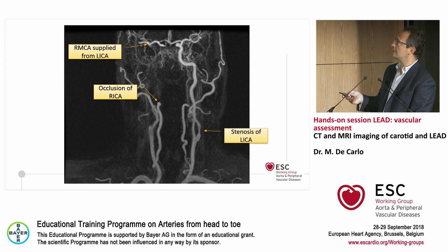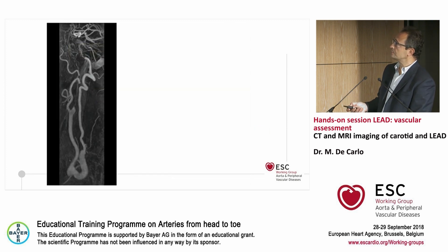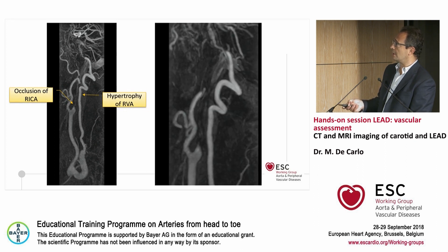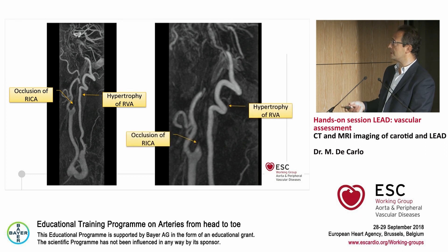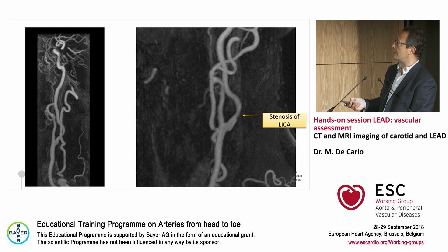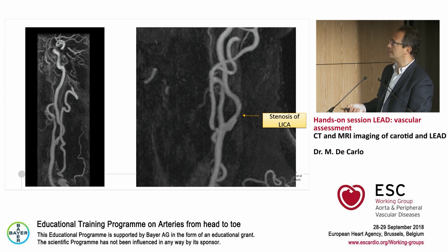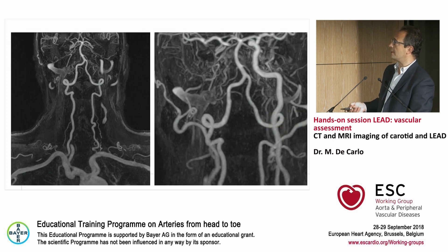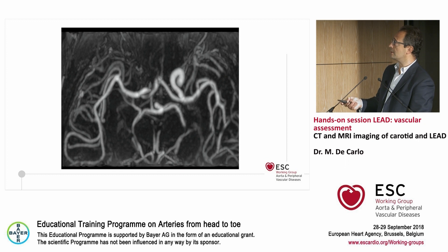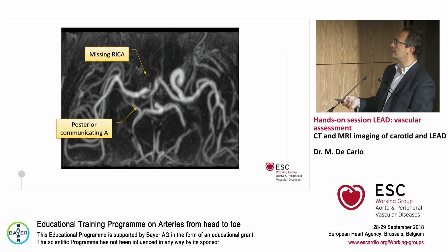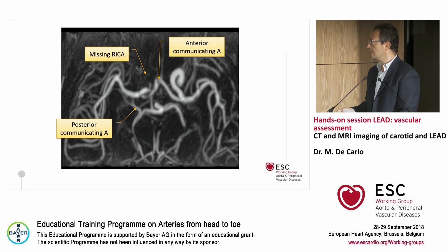On the intracranial MRA, you can see that the right middle cerebral artery is supplied from the left internal carotid artery. You can magnify the images and see the stump of the right internal carotid artery and the hypertrophic vertebral artery that compensates for the occlusion. The stenosis of the left internal carotid artery is clearly visible. You can see the posterior circulation with the basilar artery and posterior communicating arteries — the polygon of Willis — demonstrating that this patient has good collateral compensation.